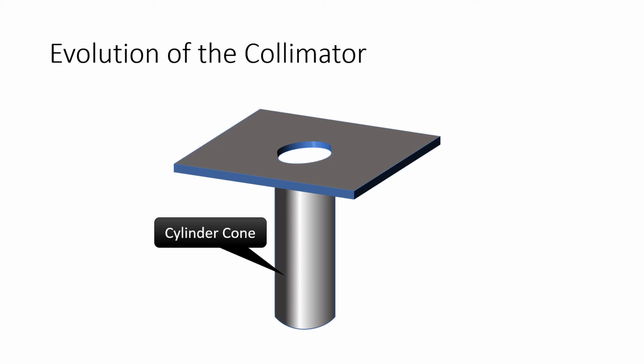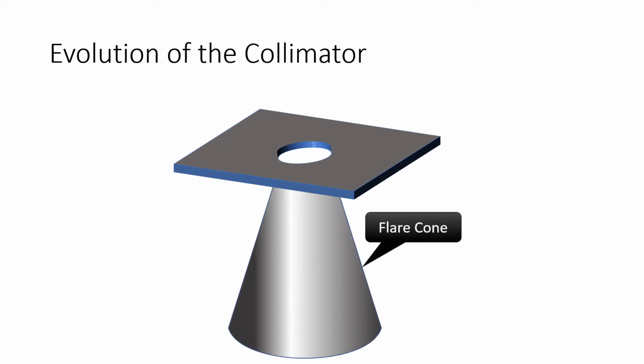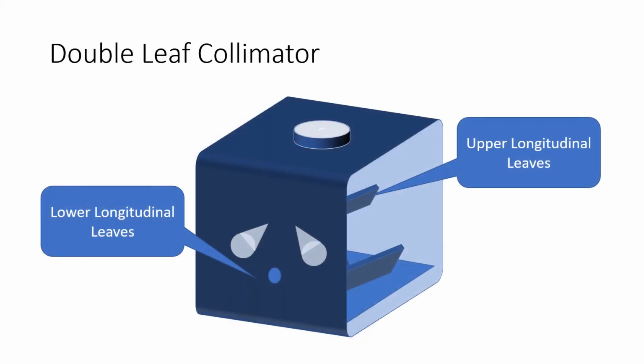The sight line of the cone would also aid the radiographer in centering the cone to the part or the cassette. If radiographers needed to cover a larger field, the cone could be flared. One problem shared by all the previous forms of collimation was that the cone or aperture diaphragm only worked in one situation. To vary the field size meant that you needed to have separate devices to fit each situation.